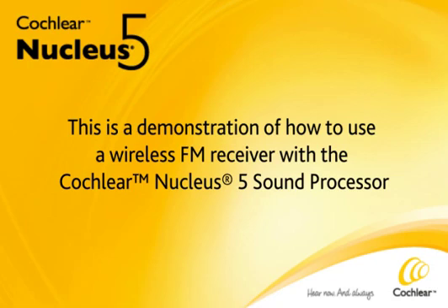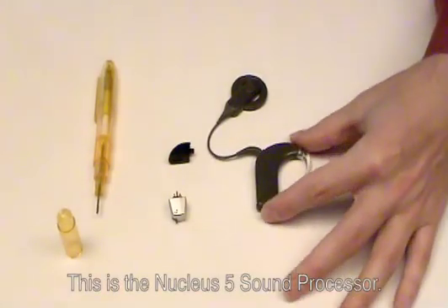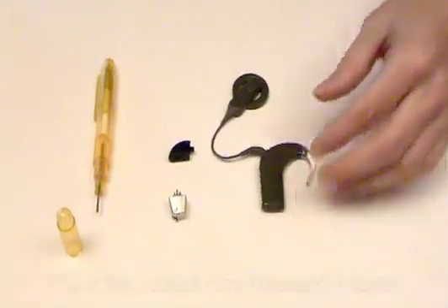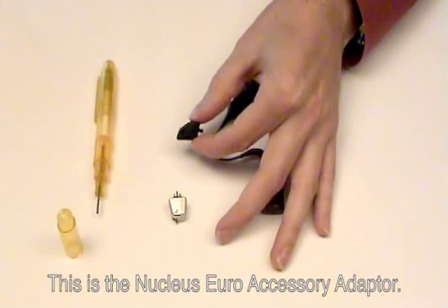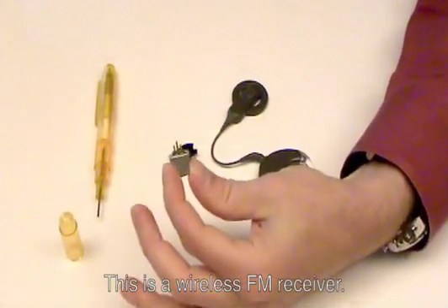This is a demonstration of how to use a wireless FM receiver with the Cochlear Nucleus 5 sound processor. This is the Nucleus 5 sound processor. This is the Nucleus Euro accessory adapter. This is a wireless FM receiver.